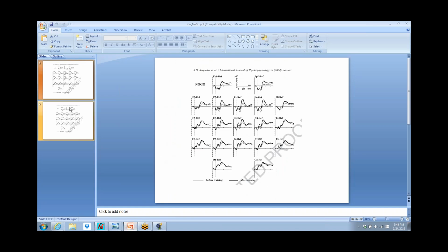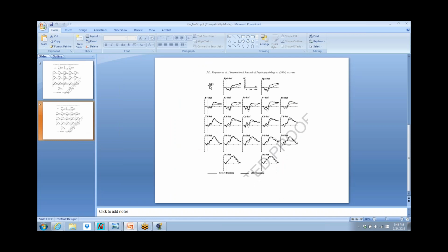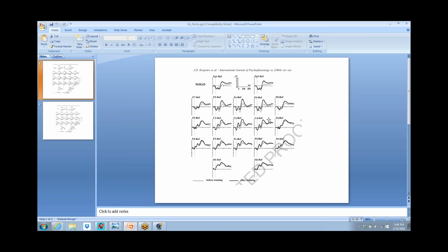Sure. I had a couple of slides that were the actual raw potentials where you add all of the components together. Sensory perception, processing, and so forth. This is the go potential. This is the no-go potential. Yeah, go back 2 more slides.